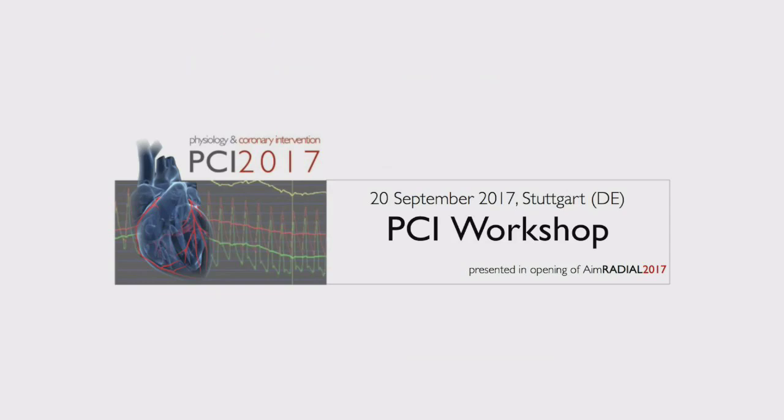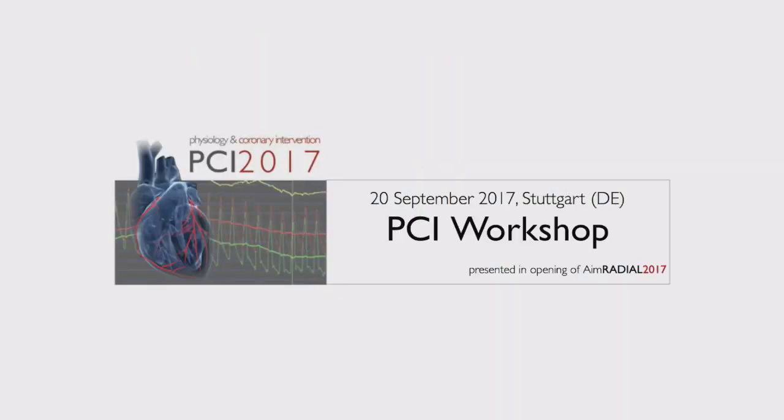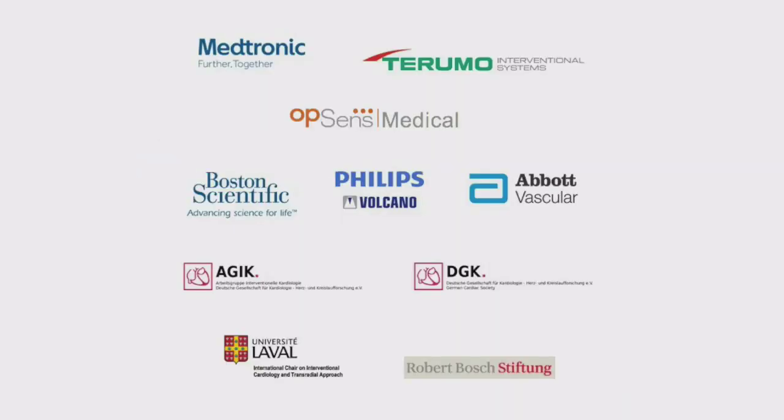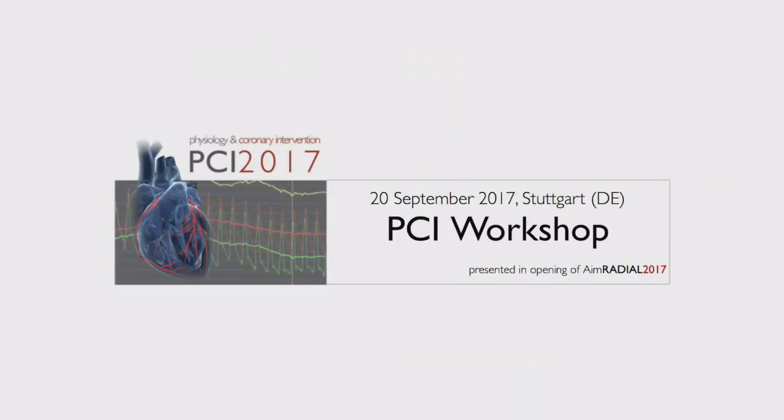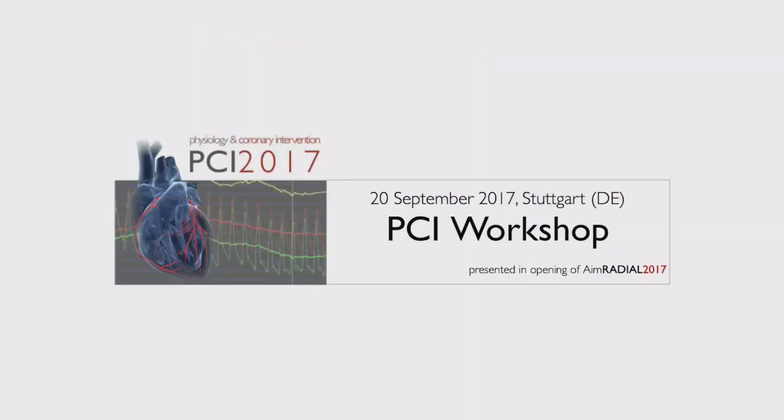That's true on a population level. But what this is saying to me is that if you arrive at a post-PCI FFR value of 0.85, and this is not technical because there is no drift that you have checked for, there is no proof to say that you must be aggressive and go on and put any number of stents, go higher with balloon inflations and so forth in order to arrive at a higher post-PCI FFR value in the hope that the patient will have a better outcome in terms of hard endpoints.